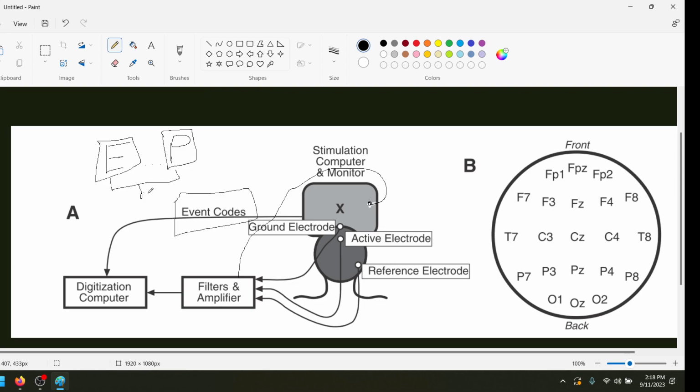That's what we're going to be doing for this class. So you guys are going to be collecting data with the monitors with no photosensor on, and then after the fact, we're going to record the delay with photosensors of all the monitors, and then when we're analyzing the data, we're going to account for that delay. It's very, very easy to do. It's a great question though, because really, nobody wants to ask or answer it for some reason.